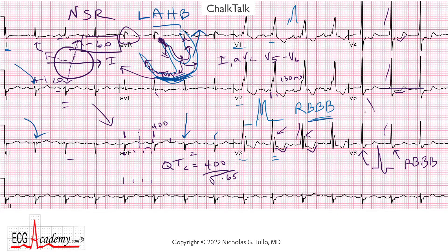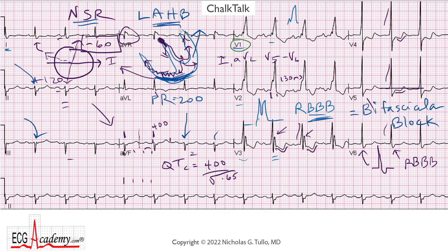Taken together with the right bundle branch block, you have to call this a bifascicular block. Otherwise, the STs look okay and there are no pathological Q waves anywhere. To pull this all together, you're dealing with a normal sinus rhythm with a right bundle branch block and a left anterior hemiblock. There's also a borderline prolonged QT interval and non-specific ST-T wave abnormalities. One last thing to notice: the P-wave in V1 has a biphasic appearance with an initial positive phase and then a big negative phase — the negative part is about one box wide and one box deep — so you might consider left atrial abnormality or left atrial enlargement. Things will sometimes pop off the page right away, but always go back and take the whole tracing step by step, looking at the rhythm, intervals, axis, and so on, so that you don't miss anything.